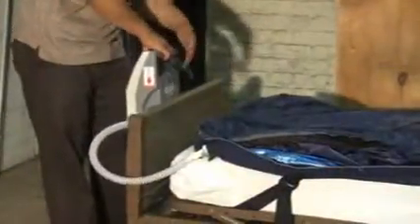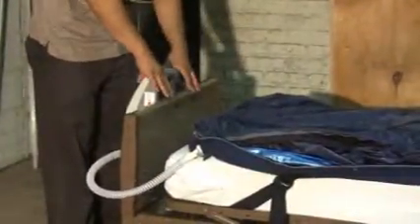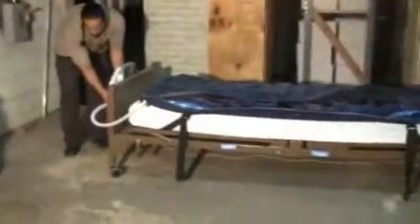On the back side of your air unit, you do have your hanging brackets, which would allow you to hang your air unit from your footboard. So our hanging brackets are open. We would hang our unit onto our footboard. Make sure our tube set is connected firmly.